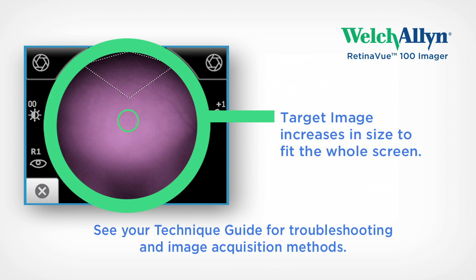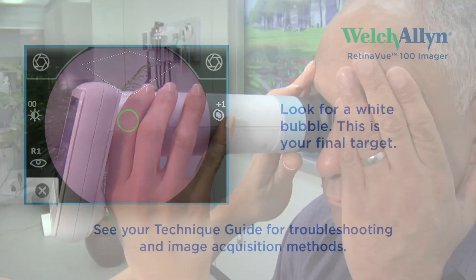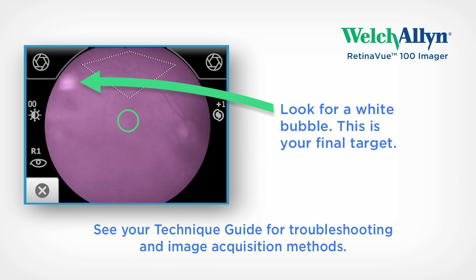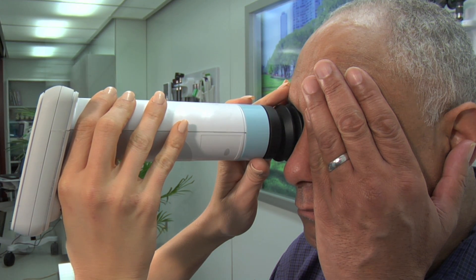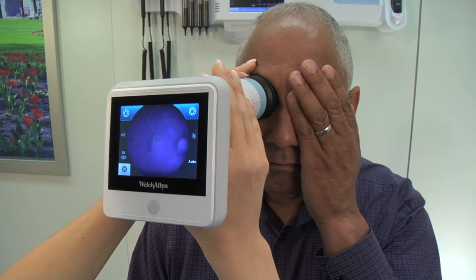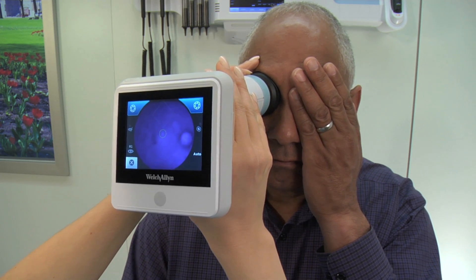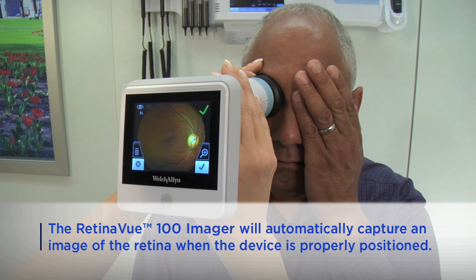Once the RV100 is positioned correctly and the image has filled the screen, continue to push forward slightly. A reflection shaped like a bubble will appear when you are in the proper position — this is your target. Simply align the bubble inside the diamond icon as shown by moving the patient end of the RV100 toward the bubble. You may have to move the RV100 slightly toward or away from the patient, or slightly left or right, to locate the bubble. The RV100 will lock in and automatically acquire the digital image once the bubble has been positioned inside the diamond icon.